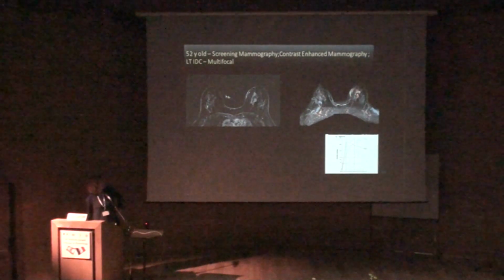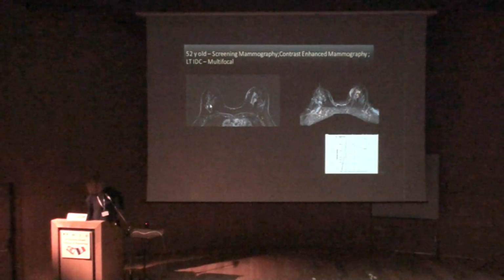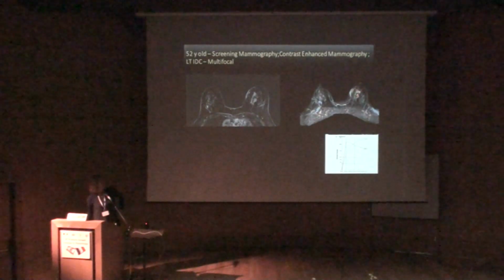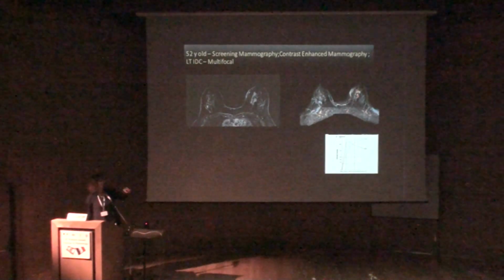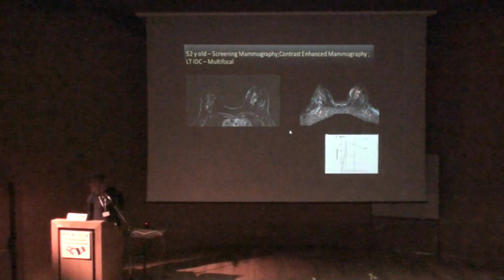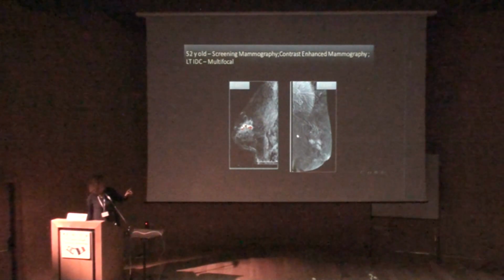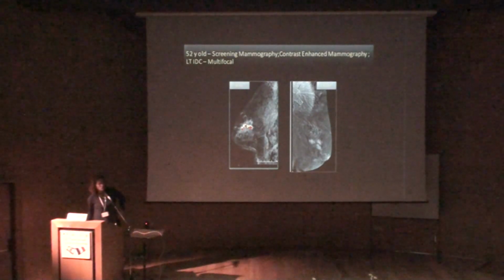And in addition, as with the breast density on mammography, with this background parenchymal enhancement, I cannot tell whether this small focus is a background parenchymal enhancement or a small lesion, so it limits our sensitivity in the interpretation or in the diagnosis of small lesions. So on MRI, we have 2 things. We have the density and we have the background parenchymal enhancement, which we commonly see. Okay, and here we can see very nicely the correlation between the contrast mammography image, the 3 lesions, and those 3 lesions on MRI. They are quite comparable.